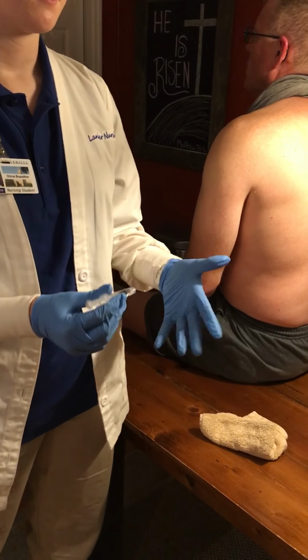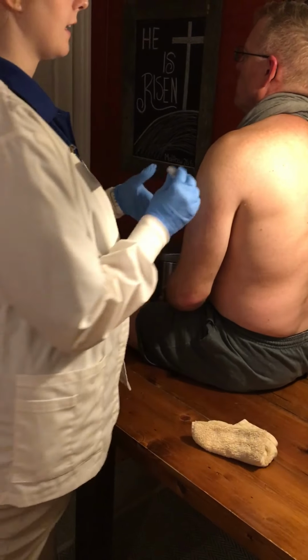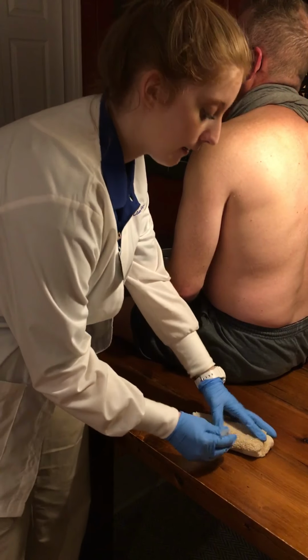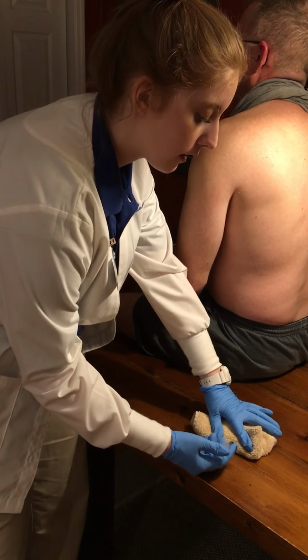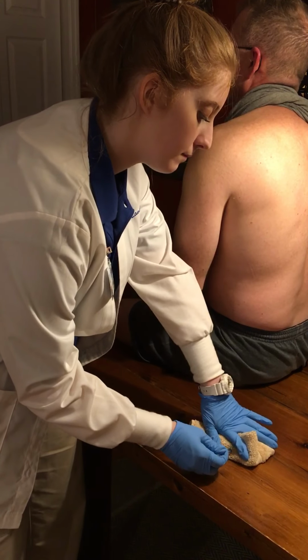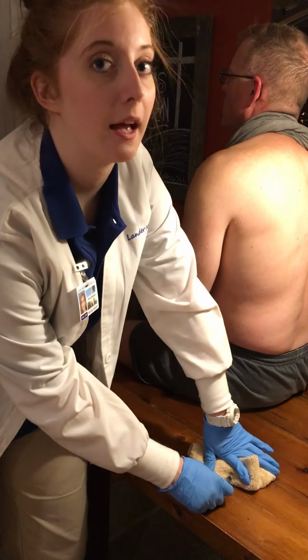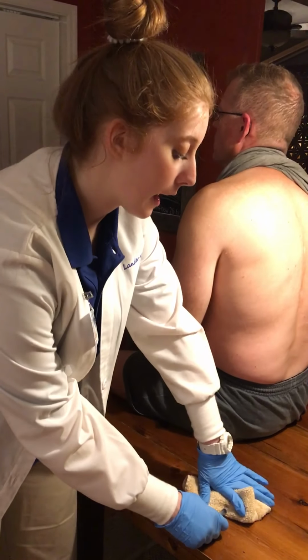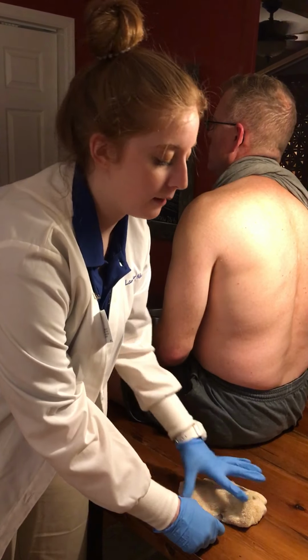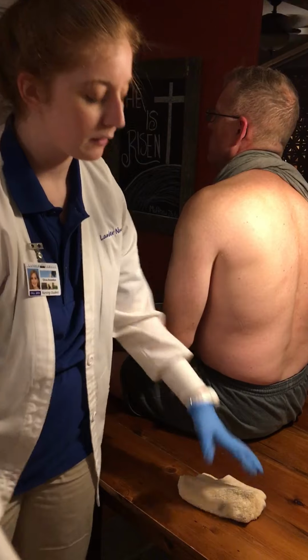So I would hold the syringe in my dominant hand as if I was holding a dart, and I would put it at a 90-degree angle, inserting it quickly and firmly, and then removing it. But before I injected it, I would have aspirated for blood if that was indicated, but in this case it was not. So I'm going to remove my needle and release the skin.